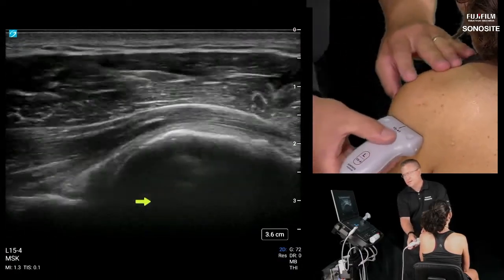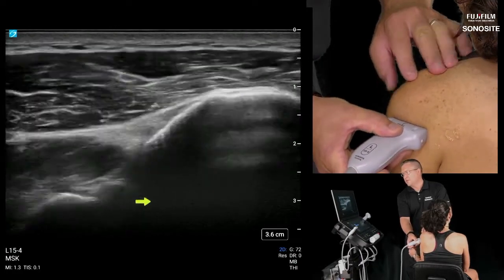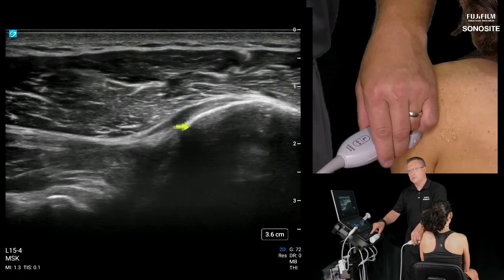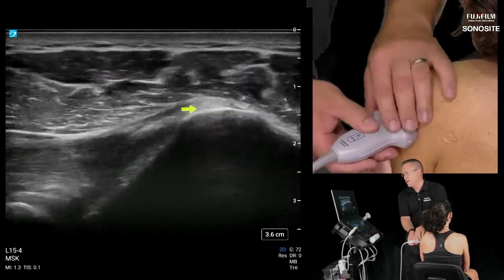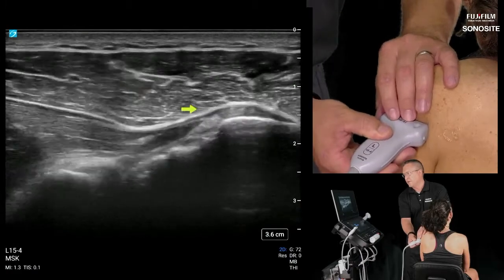So I'm going to have our patient just slowly externally rotate, and that brings the enthesis of the teres minor. And let's just hold that position, and I'll point it out. Let's internally rotate just a bit more. Let's follow that enthesis here. Here's your enthesis. And then internally rotate a little more, right about there. And we can get both the glenohumeral inferiorly with the labrum and the teres minor all in that one shot.